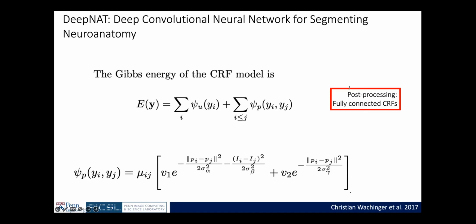How are the 7 slices being used to improve the one segmentation output in FastSurfer? As I said, you're not giving them as patches, so it sees the whole context of the image together. For a segmentation of a particular voxel, you have a voxel and you want to give a class to it. So what you essentially do is look at nearby voxels, right? This is what those 7 slices are doing. It's like patch-based segmentation. It is taking context from the first 3 slices, the slice under consideration, and the slices at the back. So it gives more context to segment that particular slice.